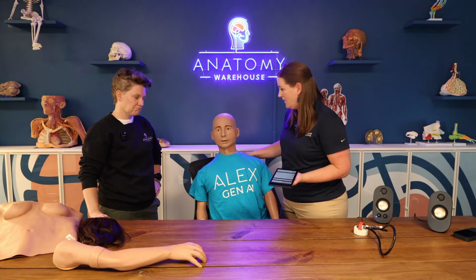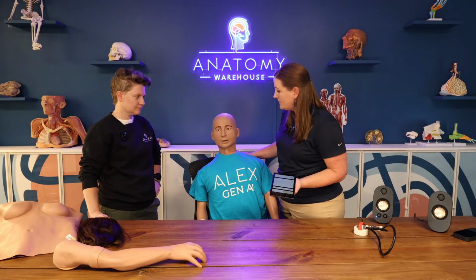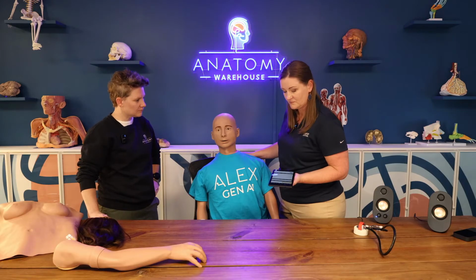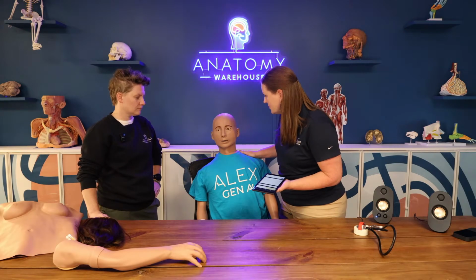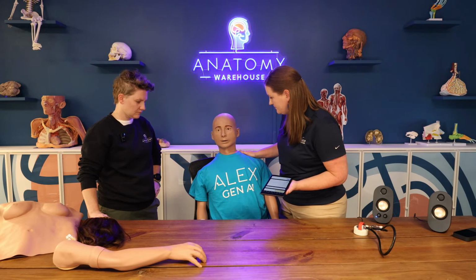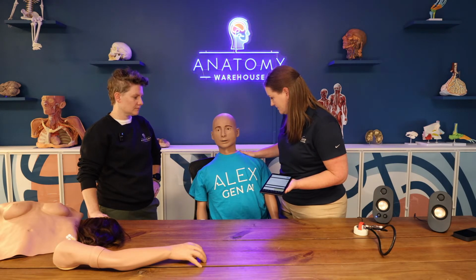Okay. Have you ever had a head injury before? No, this is the first time I've had a head injury like this. Are you having any trouble with your vision? No, my vision is fine. Okay. I'm sorry, I didn't catch that. Could you please repeat? I just wanted to make sure that you weren't having any visual issues. Are you able to see okay? Yes, I can see fine. Okay. And Andrew, how did you get here today? I was in the ambulance.